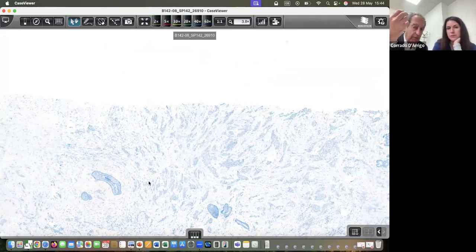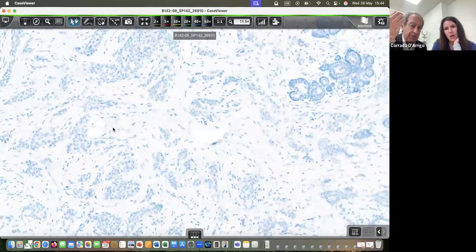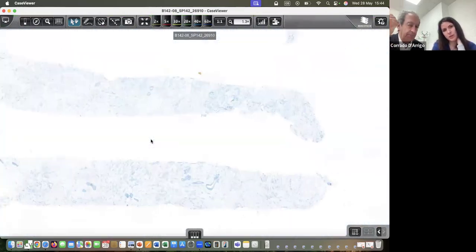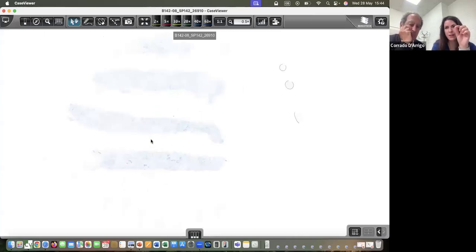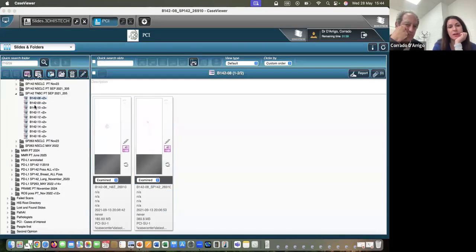Do look a little bit closer, 1 or 2 areas, just in case we are missing very, very low level staining. I think the only way we would miss it is if we had just single cells. Single cells we don't see. Yeah, it can happen.